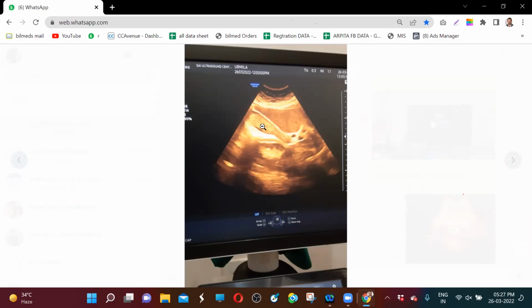So the point is, we are concluding it, that if the posterior shadows are not strong, ask yourself why they are not strong. Believe me, ultrasound is all about why, and why. You have to ask yourself questions. For example, over here, why with this much of big calculus? Of course, a small calculus may not have a strong posterior shadow, but with a 10 millimeter or a 12 millimeter calculus, I should expect a good shadow, and all of a sudden I am seeing a big calculus with a very low intensity shadow. I have to think on lines of tumefactive sludge.